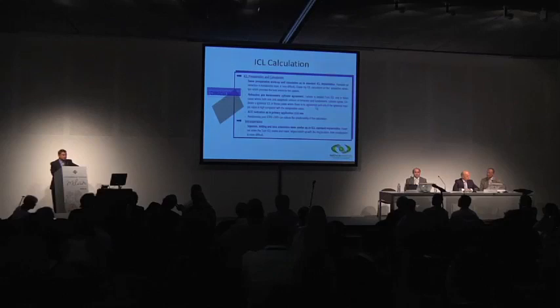When the refraction and keratometry cylinder agree, we suggest implanting the toric ICL only in those patients where the axis of the astigmatism and the amount of the refractive and keratometric cylinder agree. We indicate a spherical ICL in those cases where there is no agreement and only the spherical myopia value is high compared with the astigmatism value. Of course, patients need to have more than 3 millimeters of anterior chamber depth.